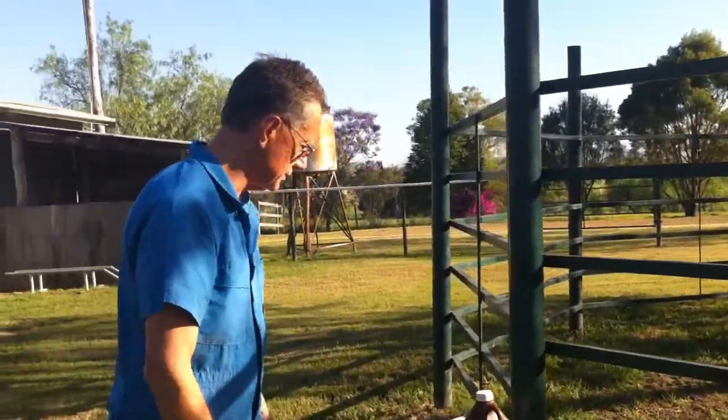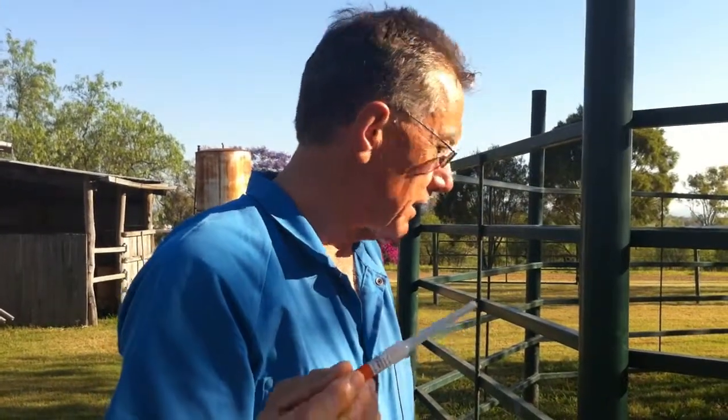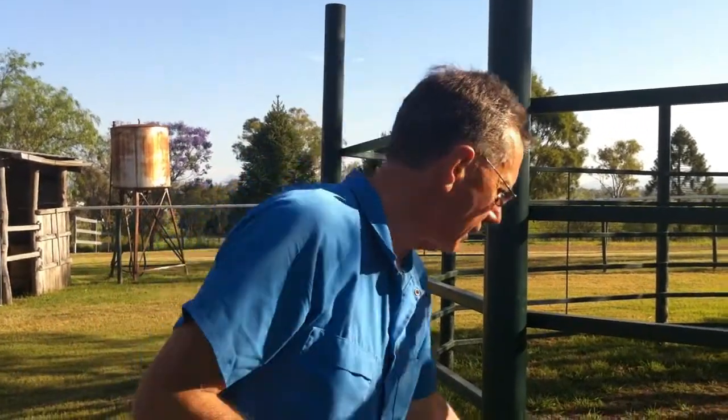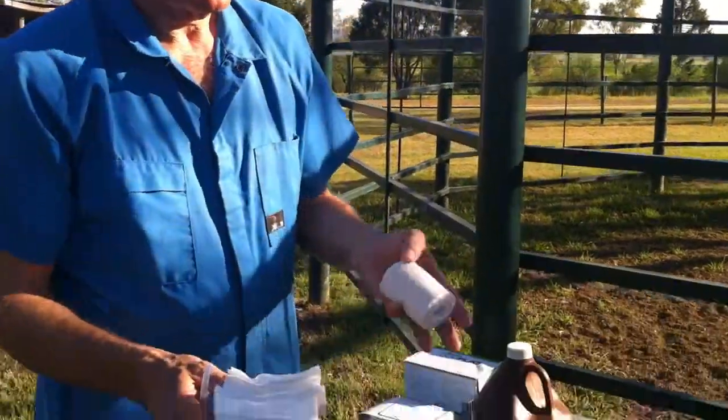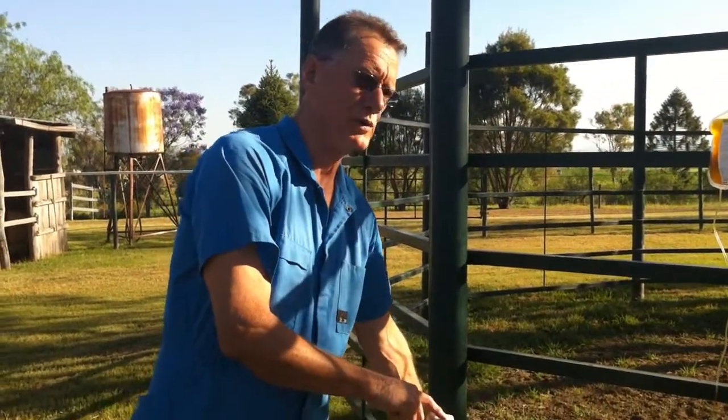I'll just show you the other equipment we need to use. We'll need an intravenous catheter — I use a 14 gauge, 2 inch catheter. That's a fairly big catheter; I know vets that use 16 gauge, 18 gauge, or 20 gauge. It doesn't matter. Your transfusion time you're aiming for is about 20 minutes. You can give it quicker, but I find it will have the best effect on the foal if it's given reasonably slowly. If you give it in a huge bolus, you might cause other problems. Additionally, I have some gauze swabs, an elastic adhesive bandage, and some antiseptic to clean the neck after I clip it with these cordless clippers. It's very important to clean the venipuncture site as well as possible, because we don't want to introduce any bacteria into the foal's bloodstream.